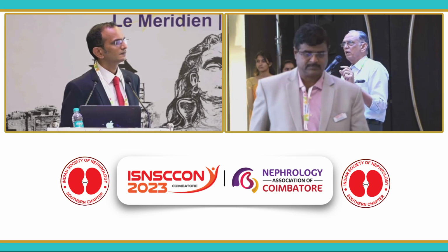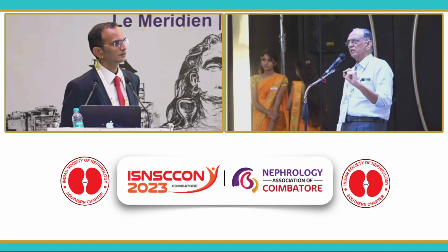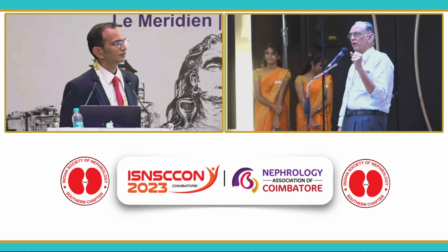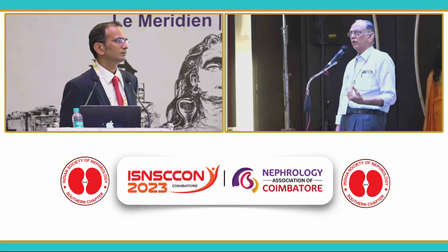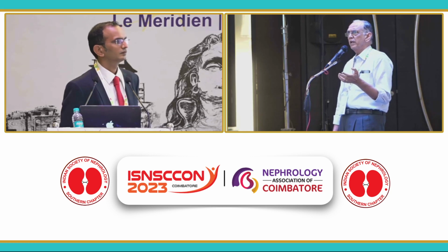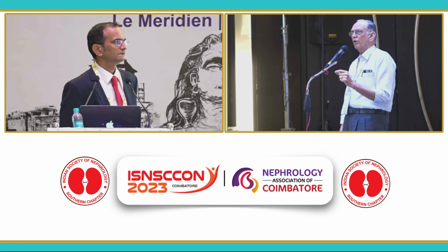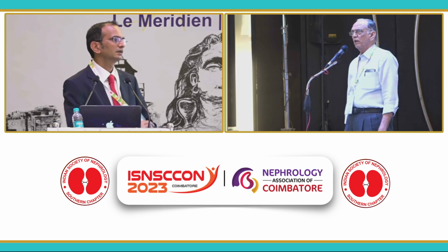Similarly, in a hemodialysis situation, even if you give a mechanical tapping of the dialysis cartridge, does the fouling decrease? That is one thing we have to consider, because after all, this is only agitation of the inner lining of your hollow fiber. The second thing I want to know is, normally in good dialysis you get a Kt/V, or you can get a urea reduction of nearly 70%. Does this procedure increase it from 70 to 80% or 70 to 75%? To what extent does it improve the urea reduction ratio?